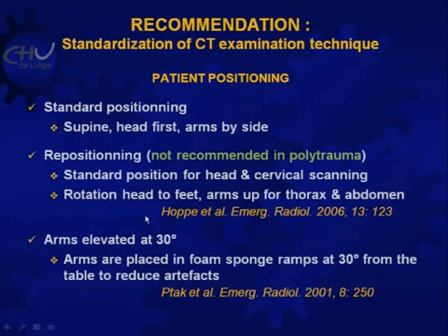First, the patient positioning. I feel that the standard positioning is supine, head first in the machine, and the arms by the side, and finish. Don't discuss anything more. In the literature there are other fancy descriptions, such as repositioning, for instance a standard position for head and cervical scanning, then rotating the patient and the arms up. It's absolutely crazy. It cannot be done with polytrauma patients.